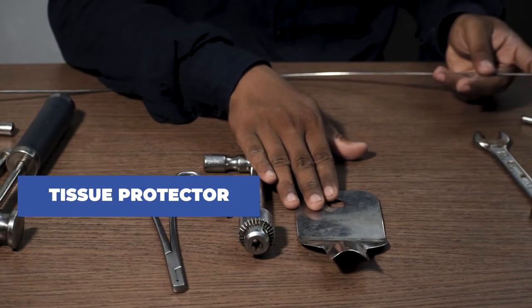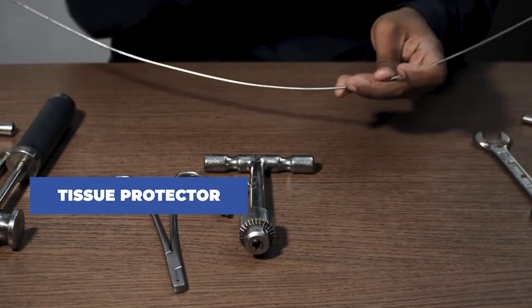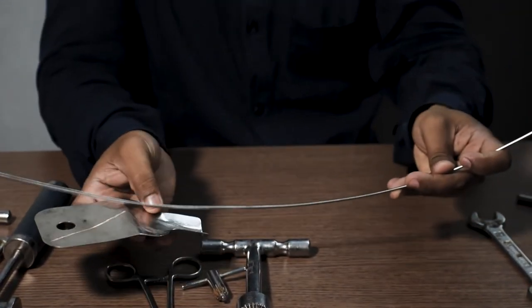This device is called a tissue protector. Now during the process of reaming, this device is used to protect the soft tissues during the reaming.